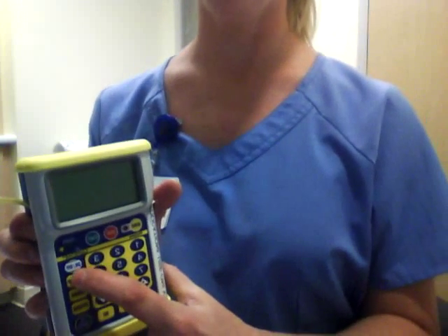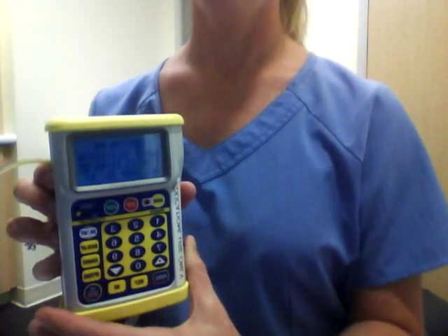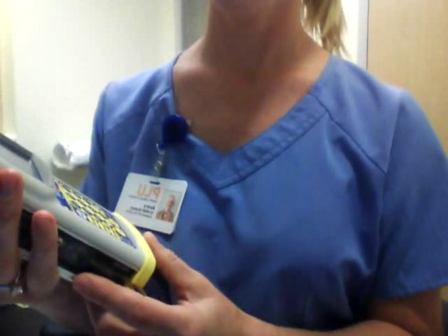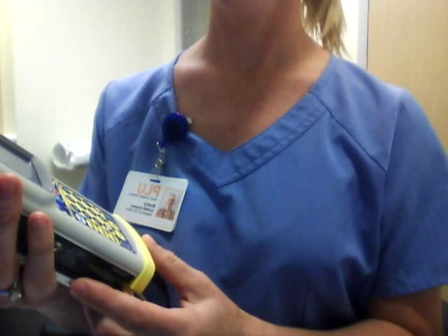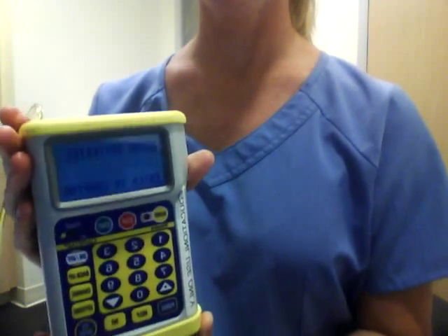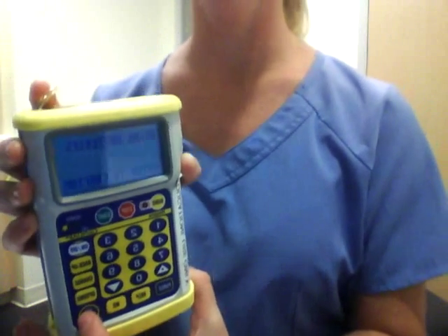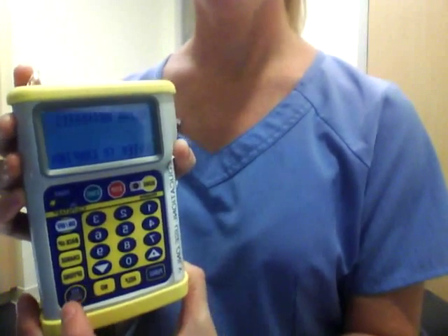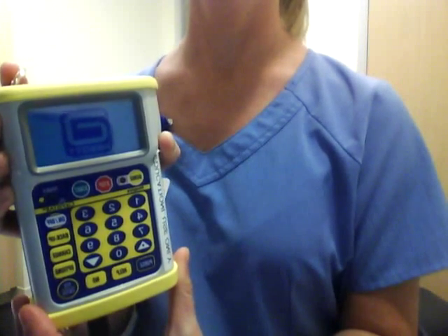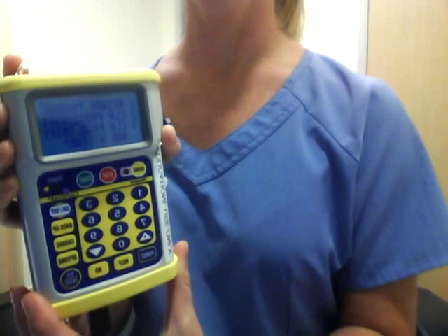To get started, you have to turn the machine on, which is this white button located here. It'll go through a self-test, which takes a few moments. It then comes to this page which says 'using batteries,' and you have to press enter to confirm. This machine only uses batteries. And then it goes through another self-test and it'll come to this page.